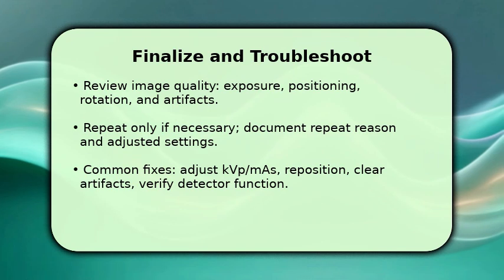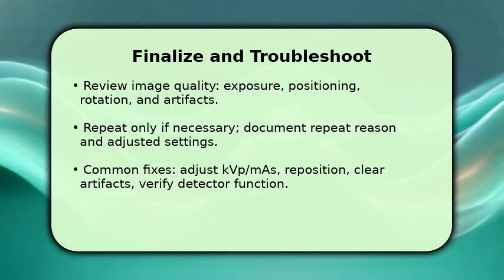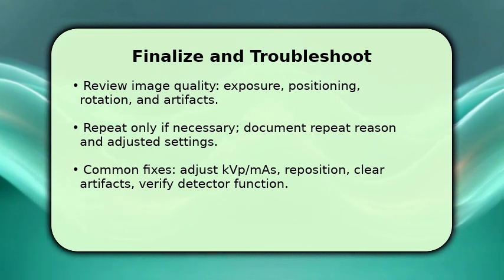One troubleshooting tip: if repeated underexposure occurs, check AEC chamber placement and backup exposure settings before further repeats.